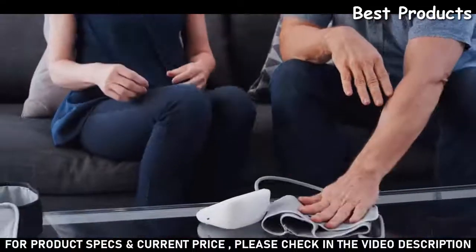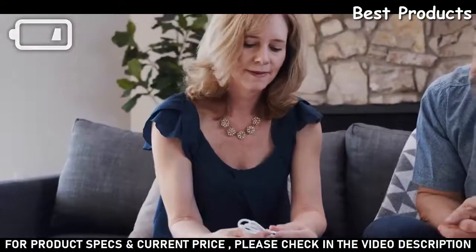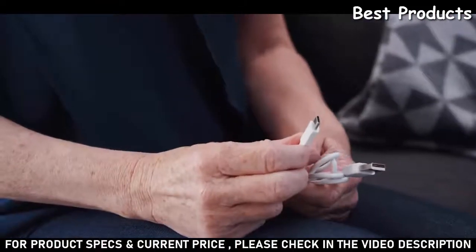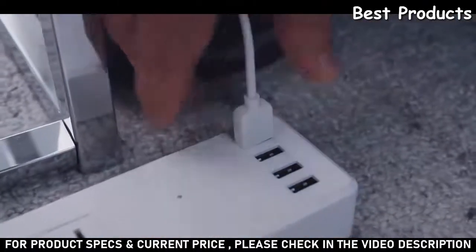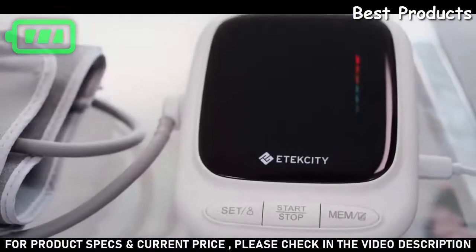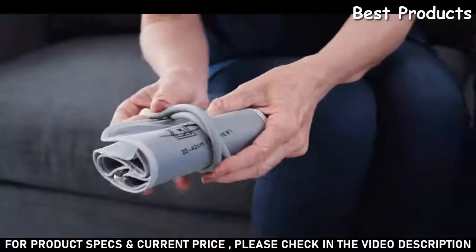When your battery is running low, the EBP UA5 can be charged easily with the included Type-C USB cable. Just plug the cord into the charging port and it can be charged from any DC 5V outlet or adapter. The device is fully charged when the indicator turns green. When you're done, just pack it in its convenient storage bag for safekeeping.